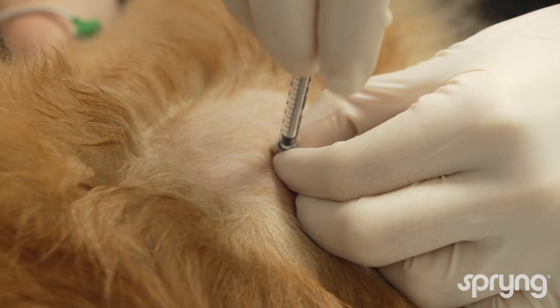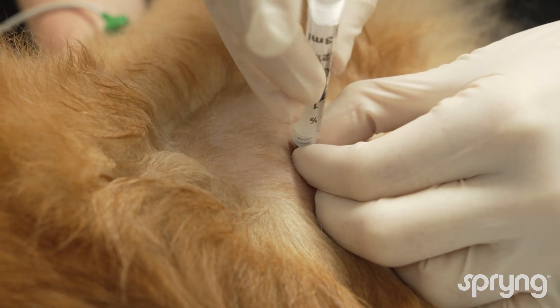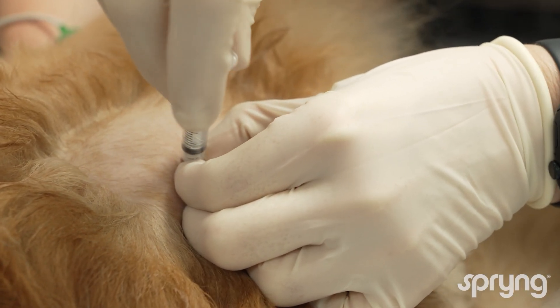A suction may be heard and joint fluid will be acquired. Inject products slowly as there should be no resistance. If resistance is met, redirect the angle and confirm appropriate placement by reacquiring joint fluid.